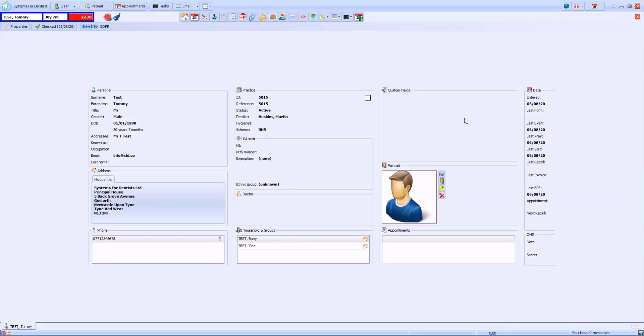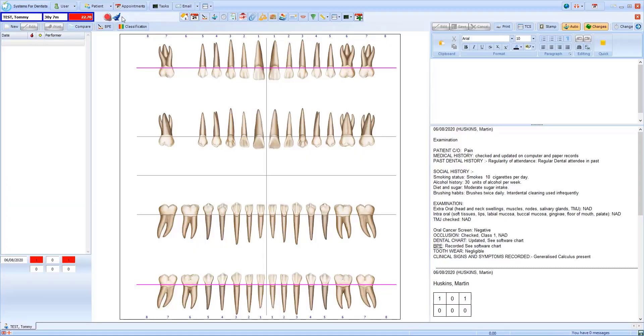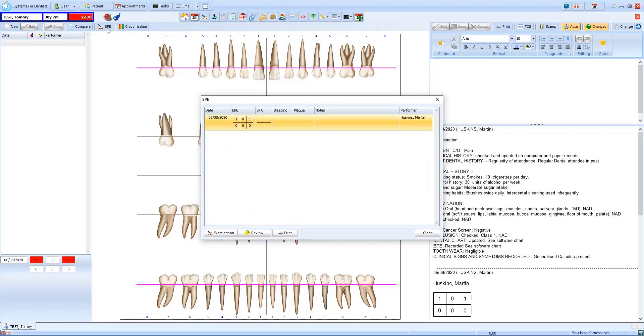One way to record a BPE is from the periodontal screen. From here I can select BPE. Recordings of previous BPEs are displayed here. To record a new BPE, select examination.